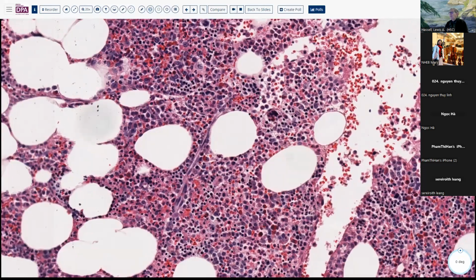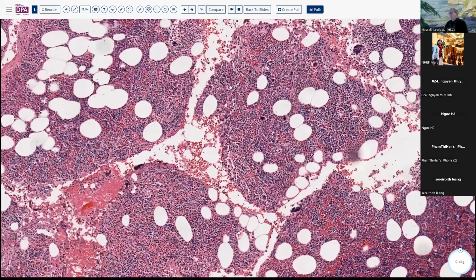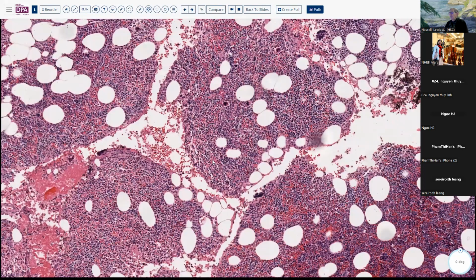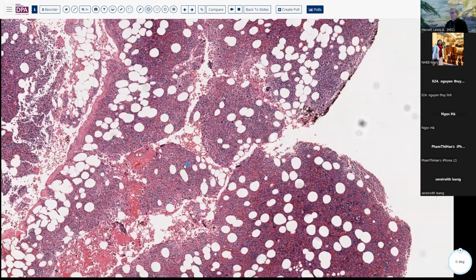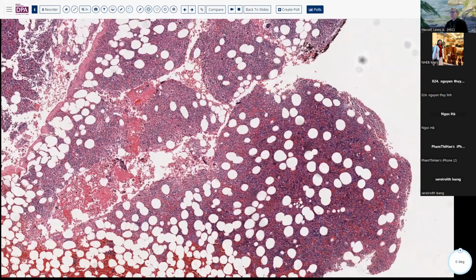Here's some megakaryocytes, here's some red cell precursors, here's some granulocytic precursors. So we see a sort of marrow-like appearance, occurring as a mass lesion in the adrenal with associated fat. So the term they use is myelolipoma. Again, this is a lesion that you're probably not likely to see come across the surgical bench, maybe at autopsy or something like that, but because it's a benign lesion, it's radiographically identifiable now.